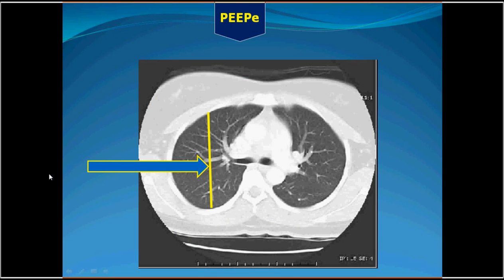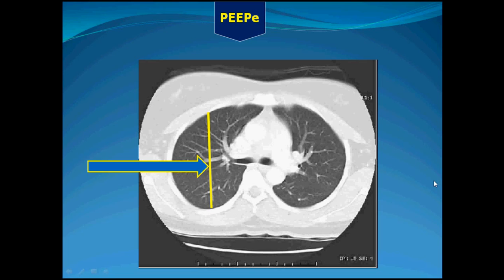Another important point should be considered. This is the lung of an adult. When you look at the distance in the supine position, it is about 30 centimeter water, and the density of lung is 1/4 of water.